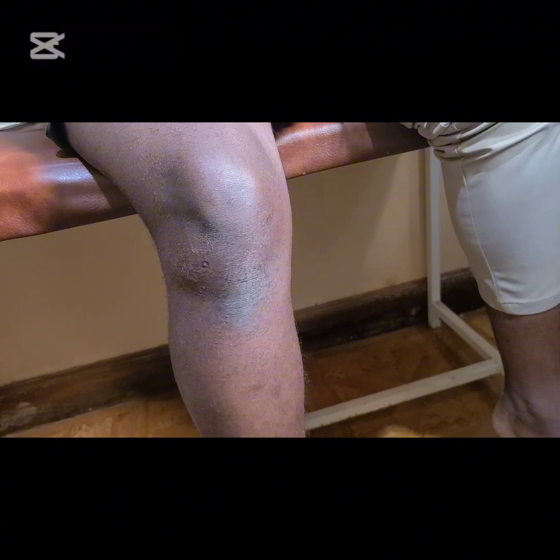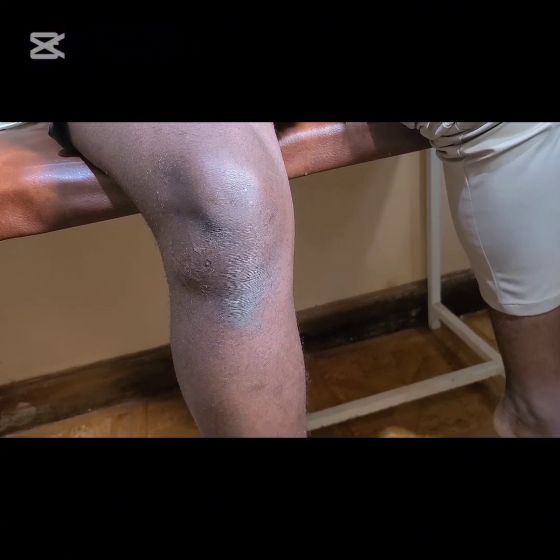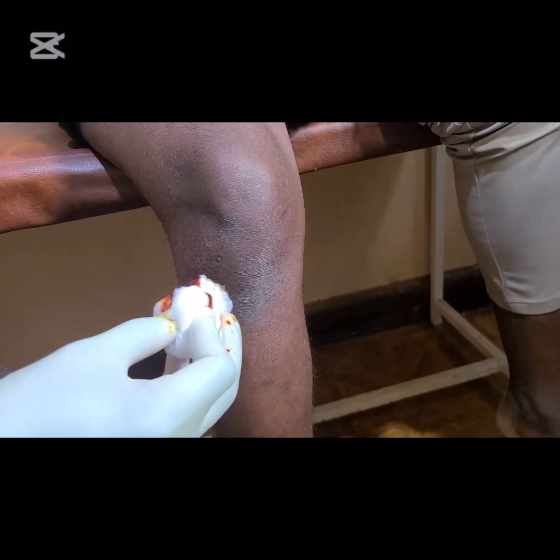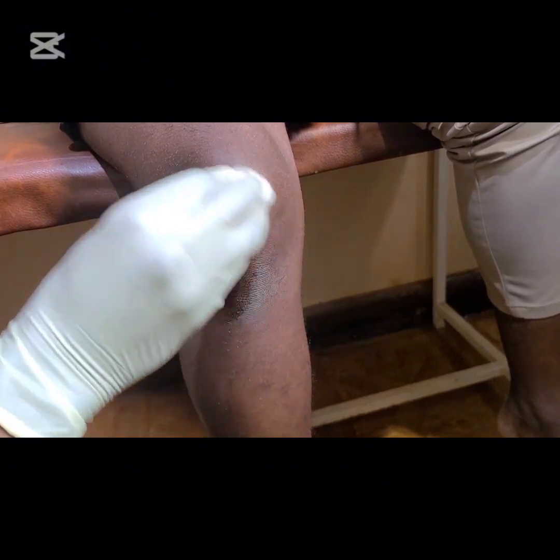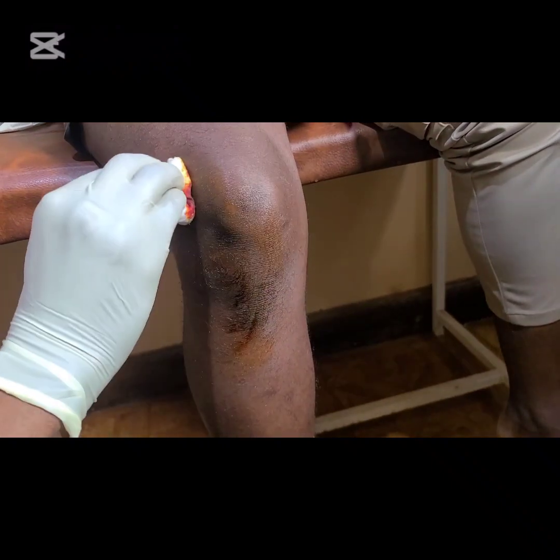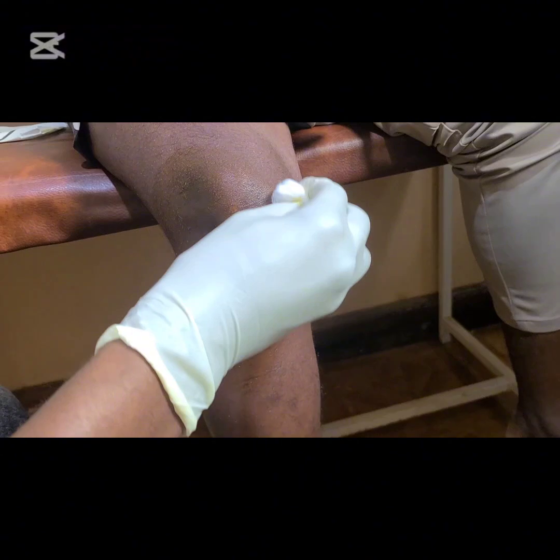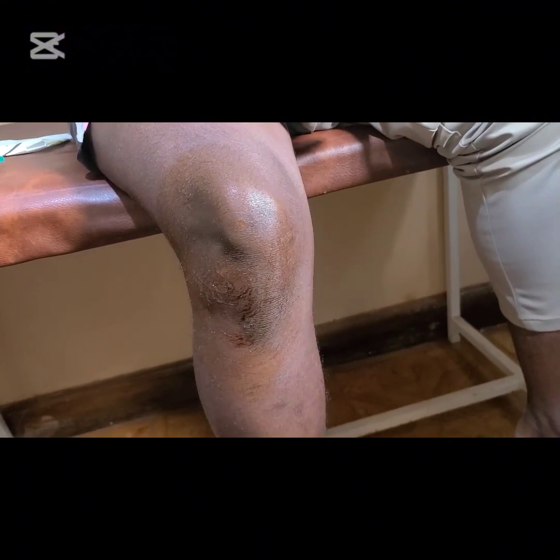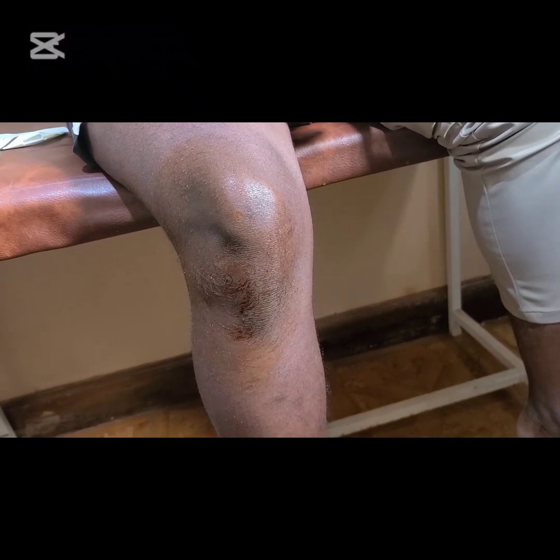So back to the injection, remember we have already identified the site of entry using our anatomical landmarks. Today we are using the knee, and these anatomical landmarks define each and every joint. So after getting to know where our introduction of the injection will be, we shall proceed and clean our knee aseptically in all those aseptic techniques. Remember, we are moving from the external environment into the knee cavity, so we don't want to introduce any microbes into the knee, because this is an aseptic procedure.